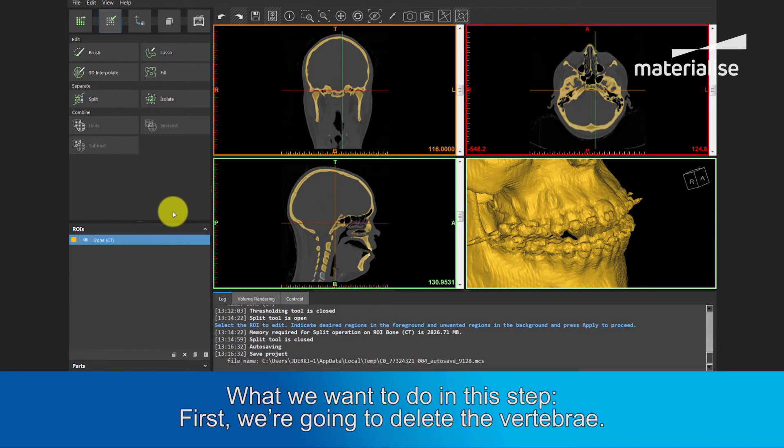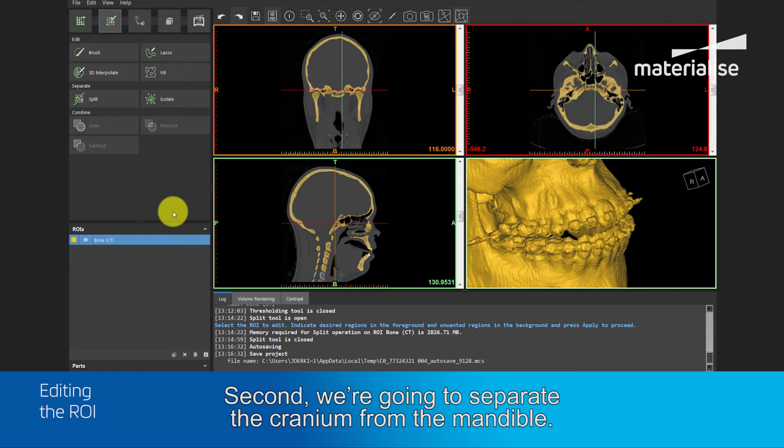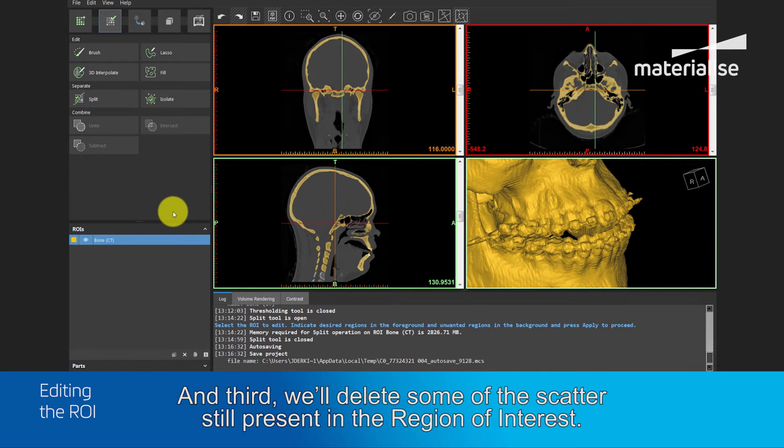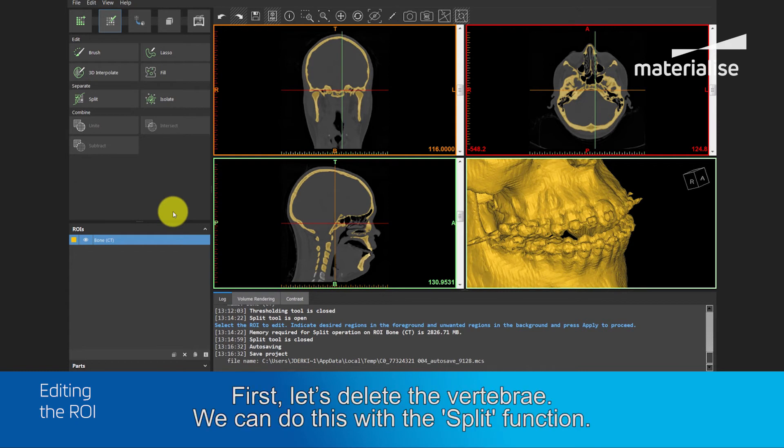What do we want to do in this step? First, we are going to delete the vertebra. Second, we will separate the cranium from the mandible, and third, we will delete some of the scatter still present in the region of interest. First, let's delete the vertebra.